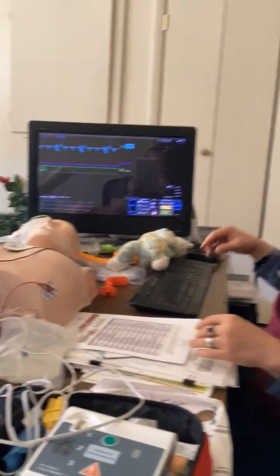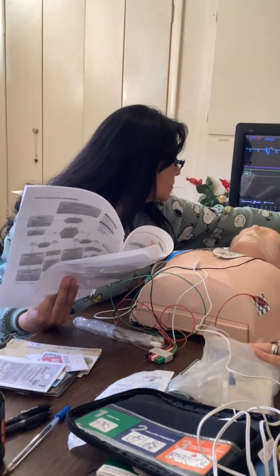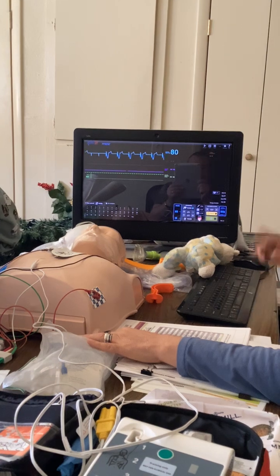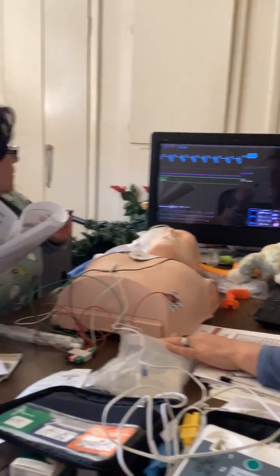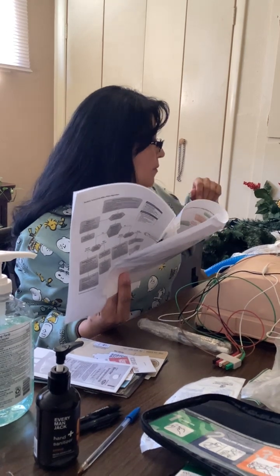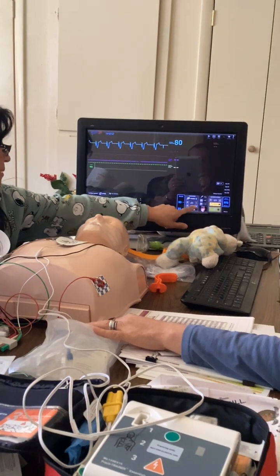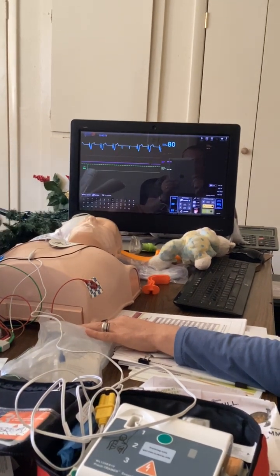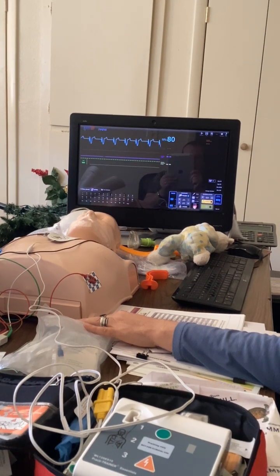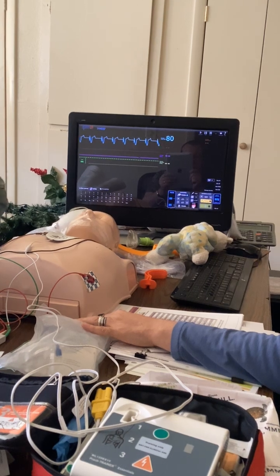No. So keep turning up your milliamps, and I'm going to be correlating perhaps a femoral pulse to see if we have mechanical capture. Do we have electrical capture? Yes. They're still doing CPR, but the pulse is still not at a rate of 80, or whatever I have it set at. So increase the amps. What's your milliamps at now? 25. I feel a rate of 80. Okay, so we've got mechanical capture. Okay, so I will increase the amps again.